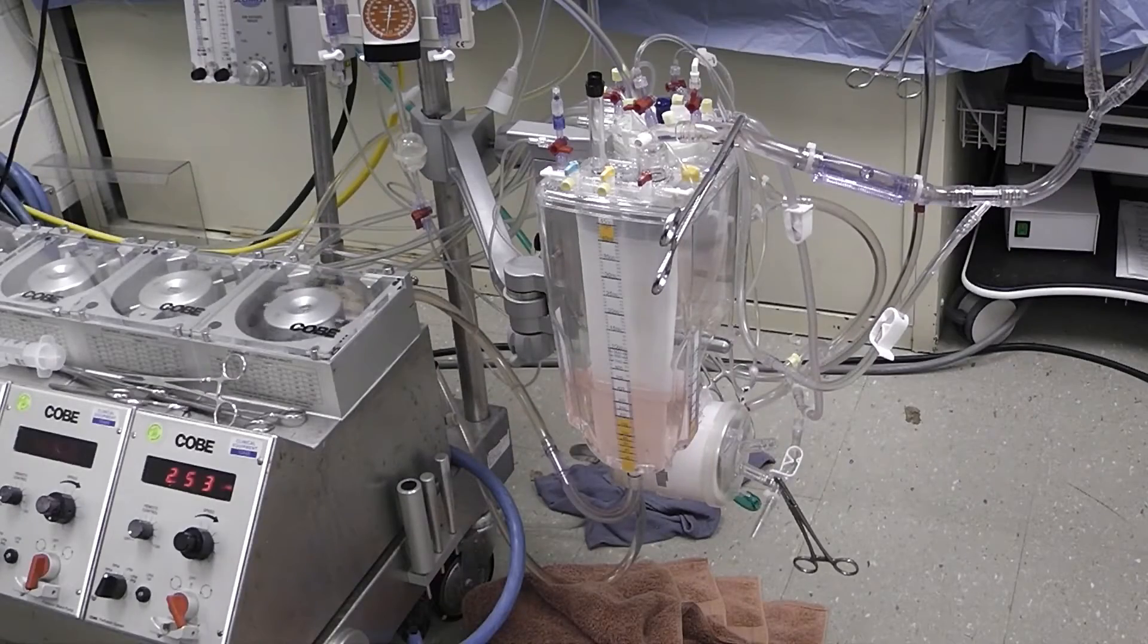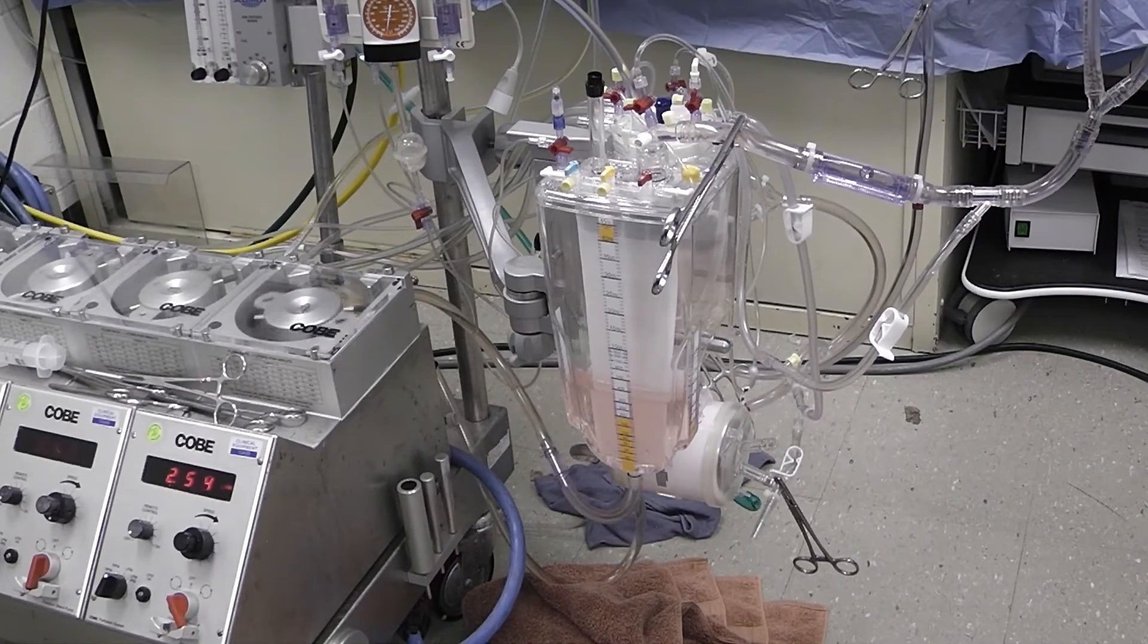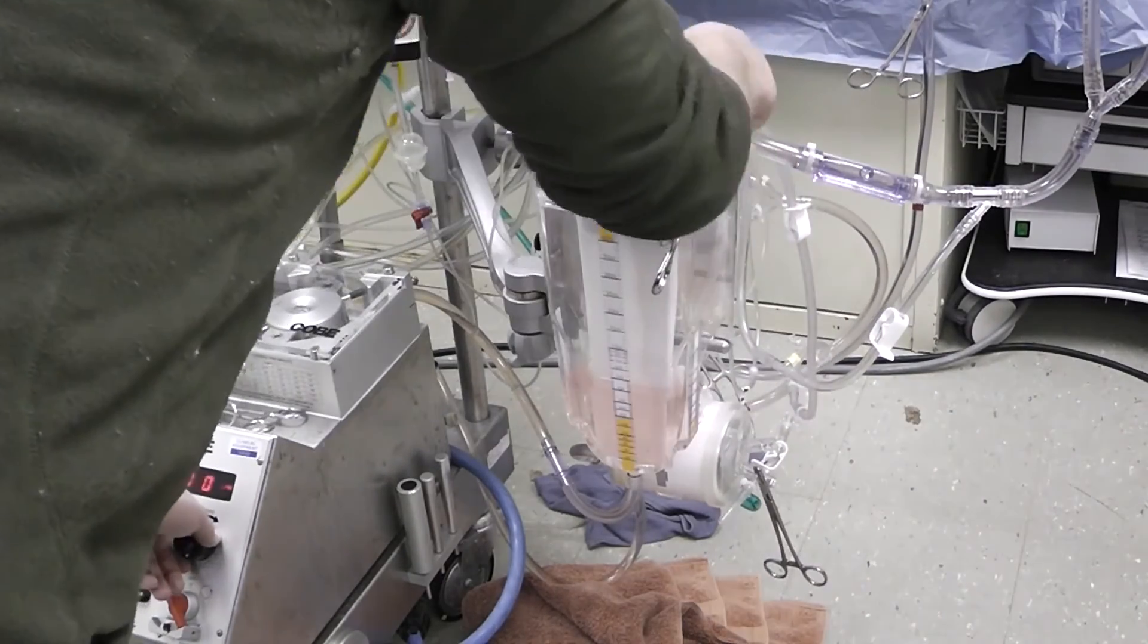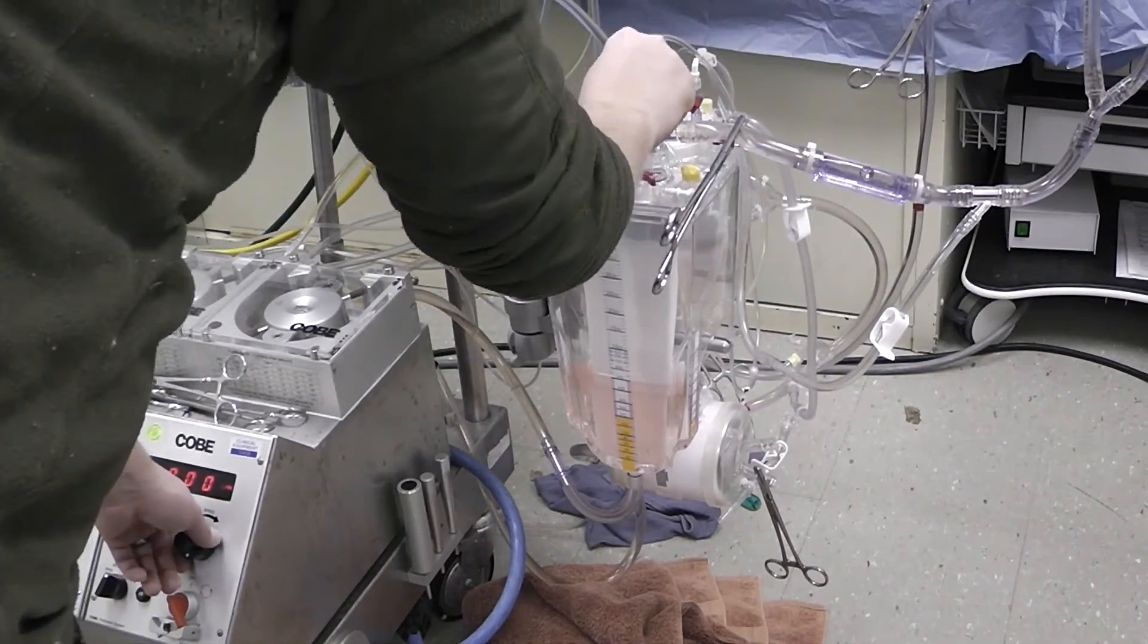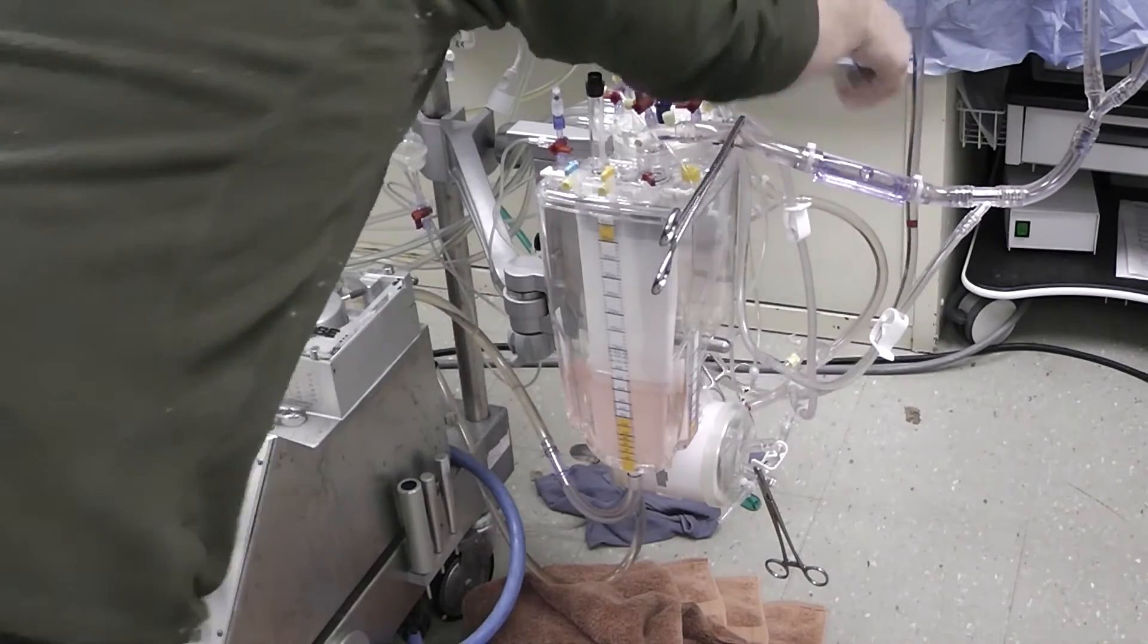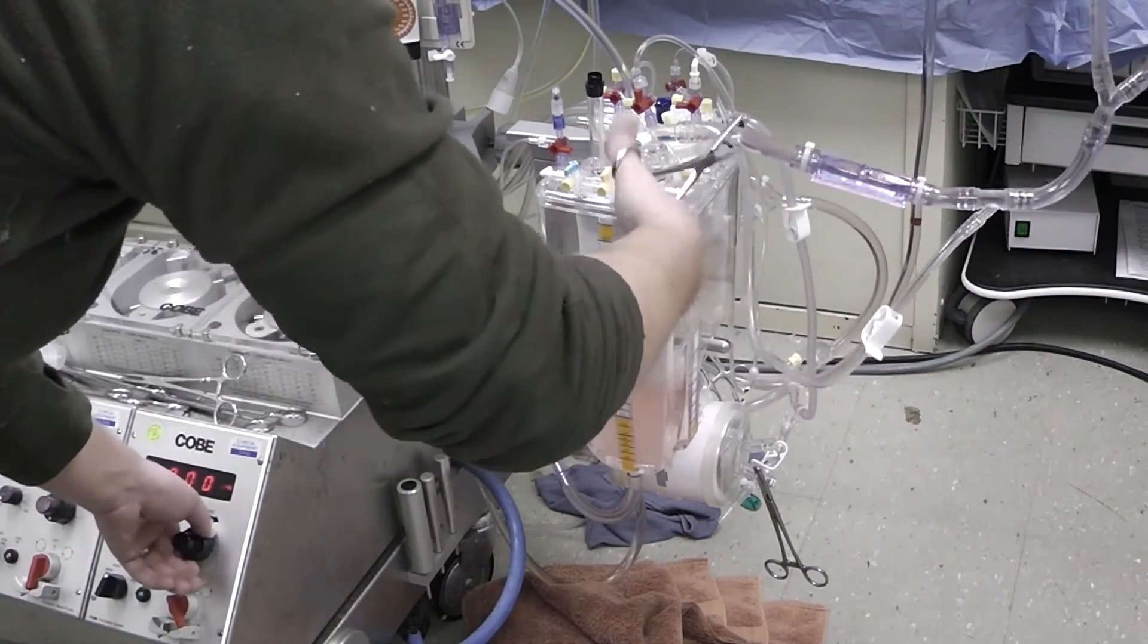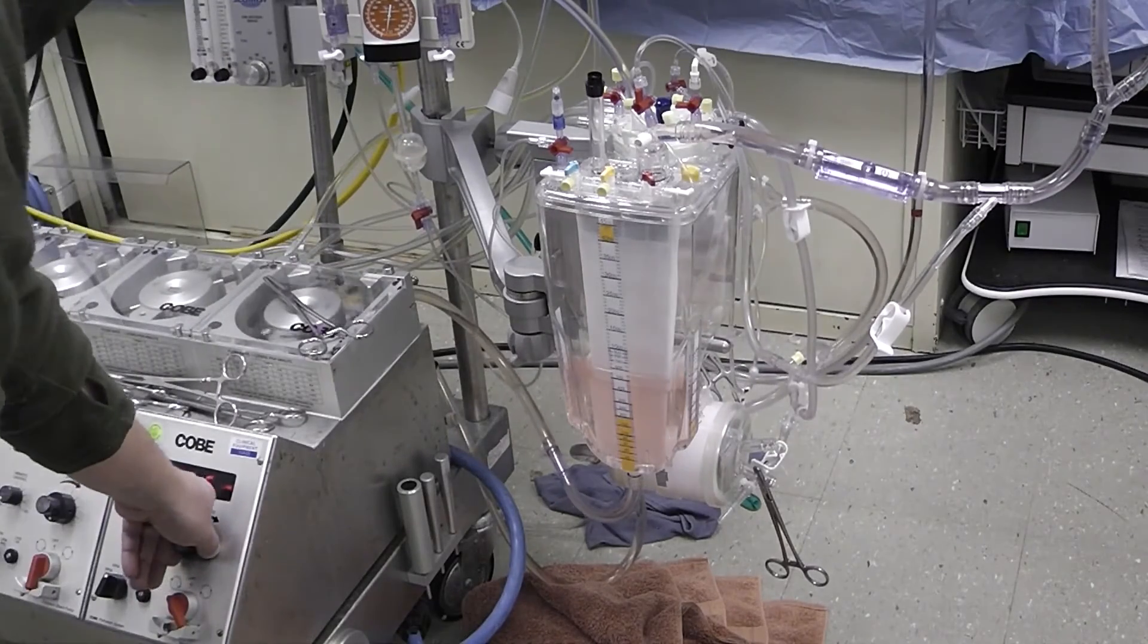Now we're going to shut down the pump so that we can reinitiate bypass. So I'm going to shut down the pump, close all the purges, I'm going to remove the arterial line clamp that was still remaining, turn the pump back on, and reinitiate flow.